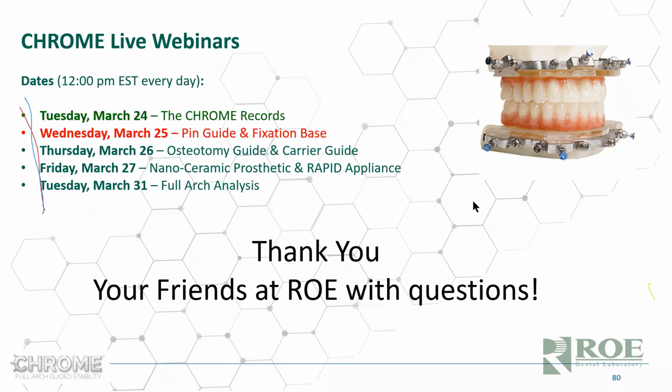Should we equilibrate the bite at the time of the JC try-in? Absolutely. Thank you, Raj, for that question. Often the JC try-in goes out and it comes back and it says, good, start making chrome. Well, without any burr marks or anything or a new bite registration. Now we can trust you, smiley face, we can trust you for sure. But our suggestion is to finally equilibrate it until it's just right.